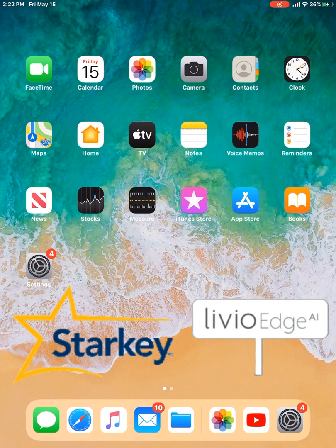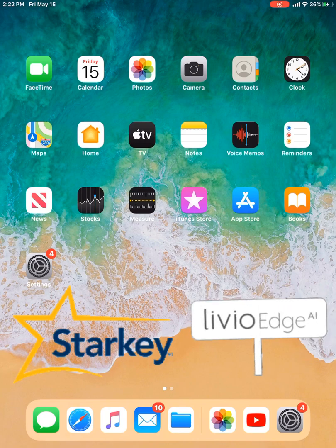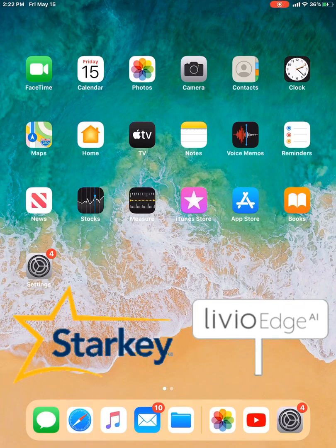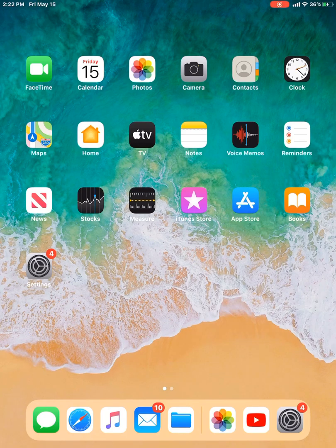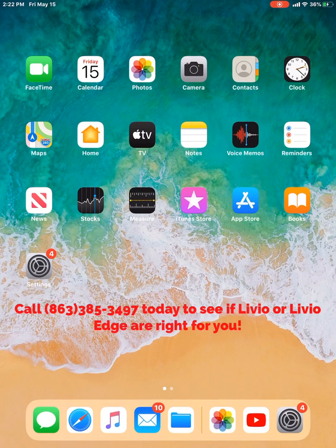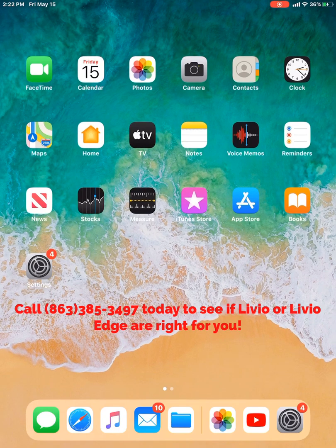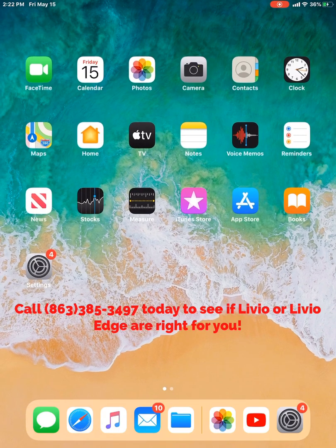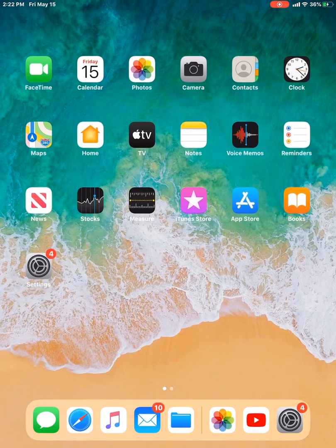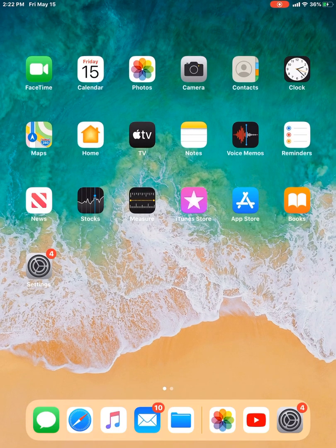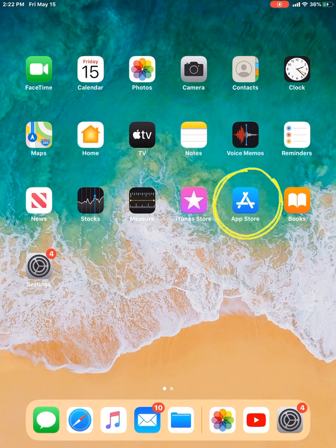So if you do not have either of those modeled hearing aids, contact your hearing health care professional and see if they're right for you. So I'm going to go into our app store, which is that little blue icon with the A. I'll tap that.